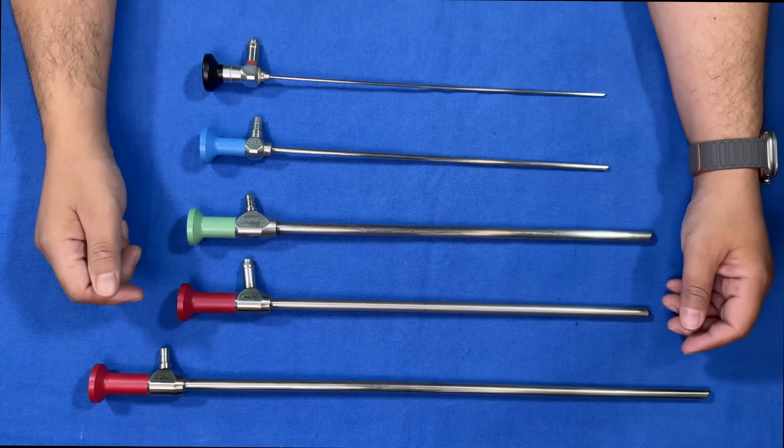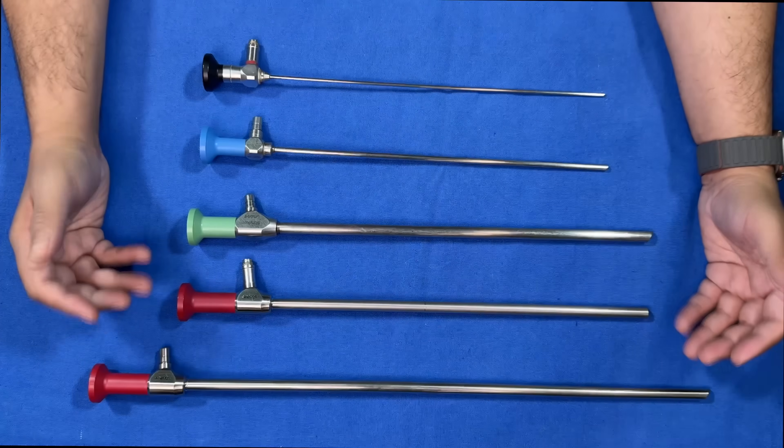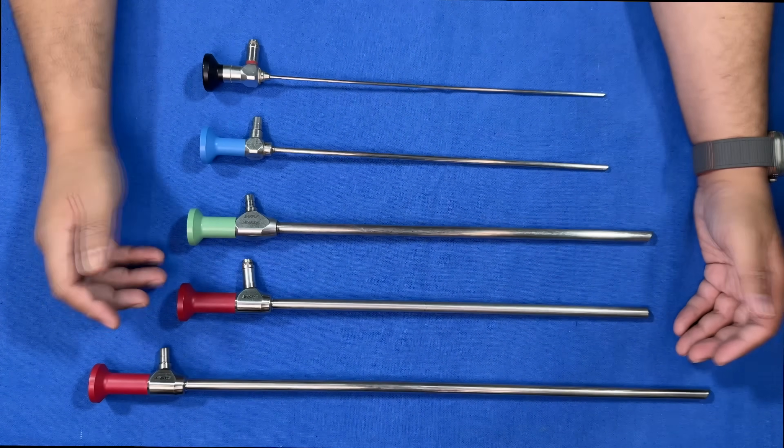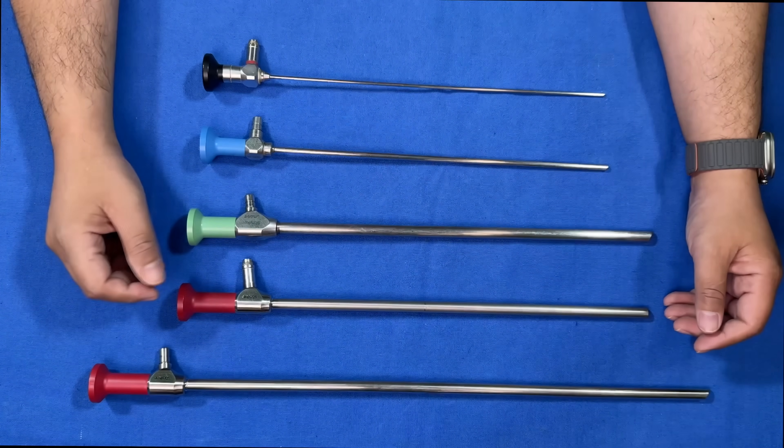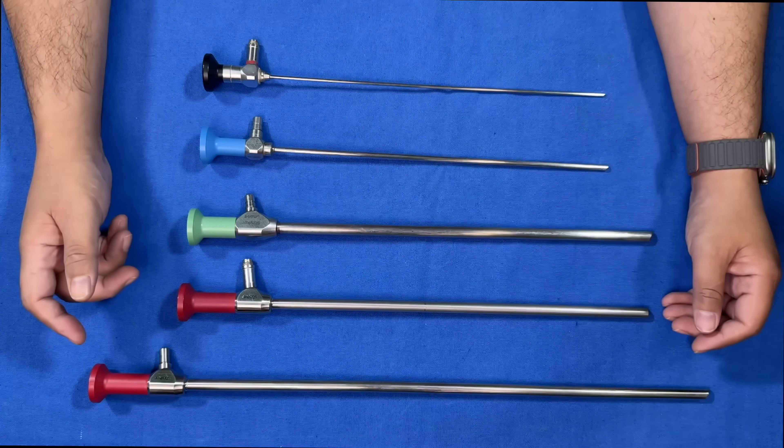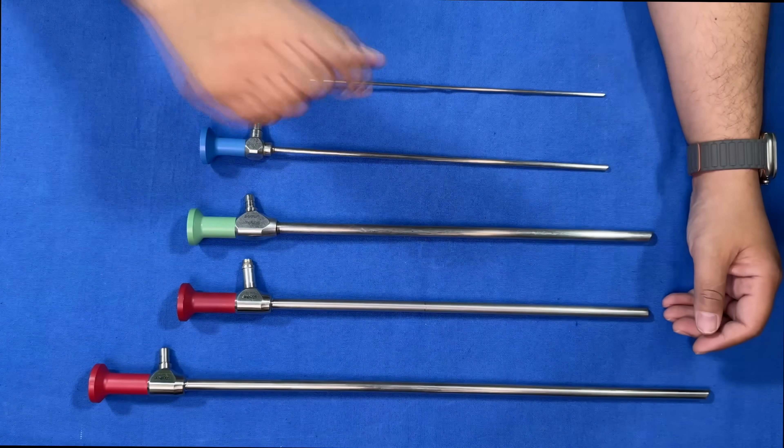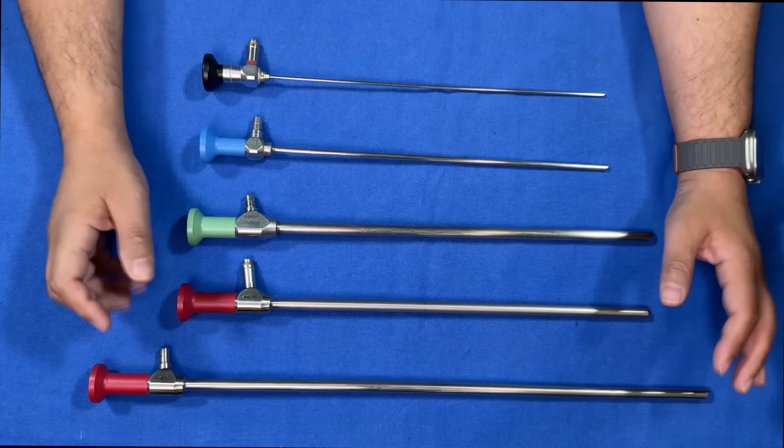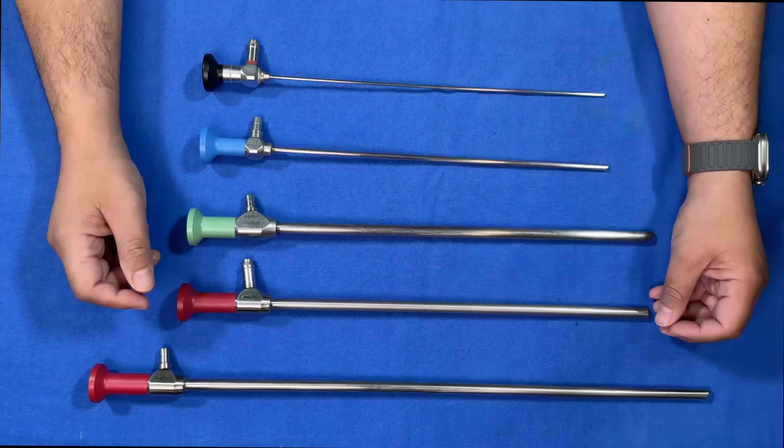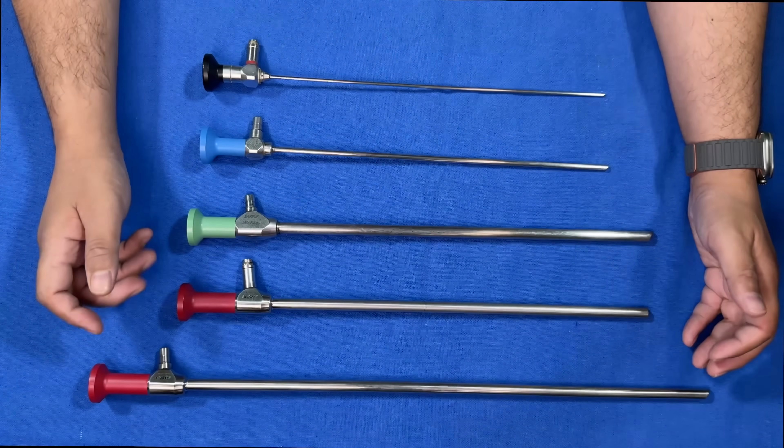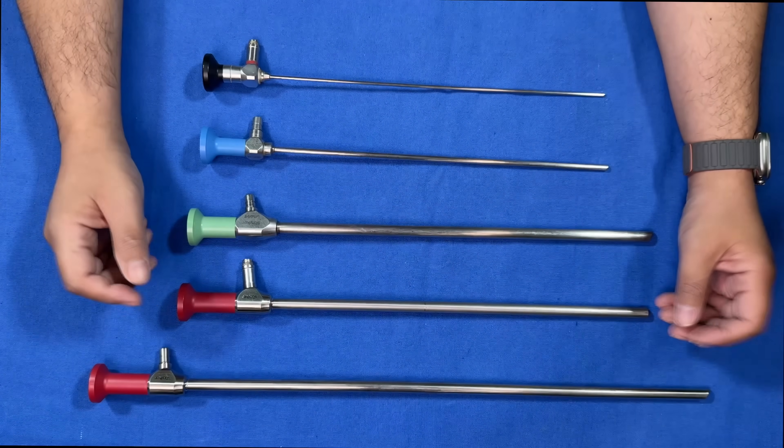For newer doctors or surgeons learning the procedures, this might be a little easier because the assistant doesn't have to rotate the camera and the error in showing a wrong angle gets negated. But most surgeons these days tend to train on a 30 degree camera straight away.